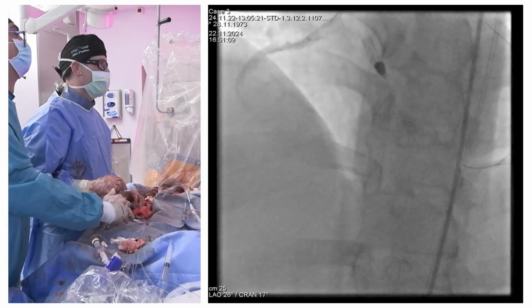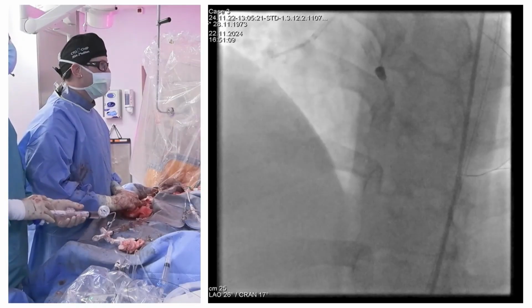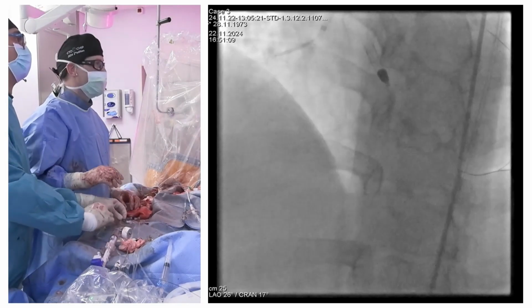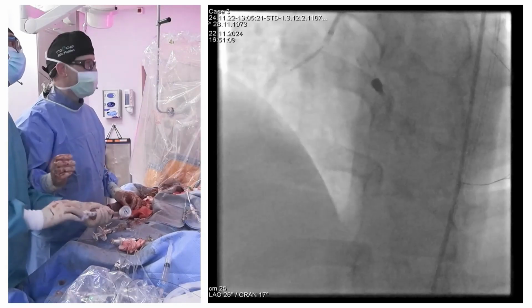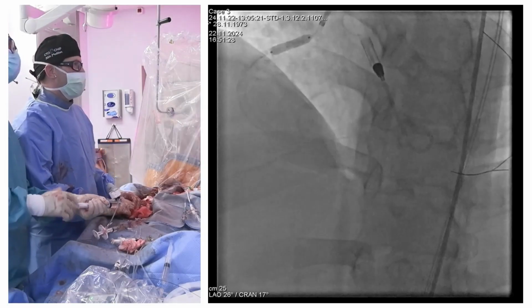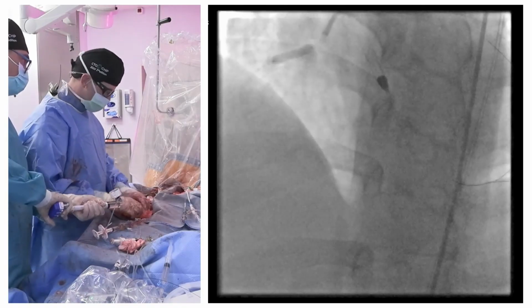Where is it coming from? Actually, it's coming from the bare metal stent era, because then we really tried to avoid the long stents, and we very often left long interventions just with balloon, or maybe even what Felix also mentioned, spot stent. And then we see actually that if patients come back in 6-8 weeks, or even maybe for longer periods, then you can fix this with a very short one. And that's why I guess it is really important.